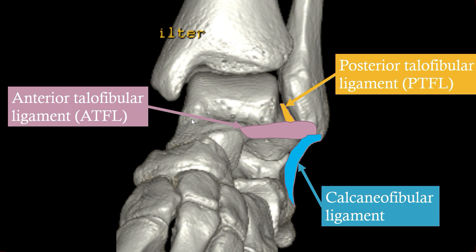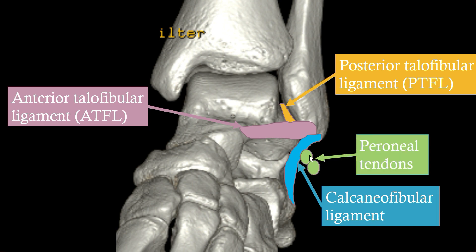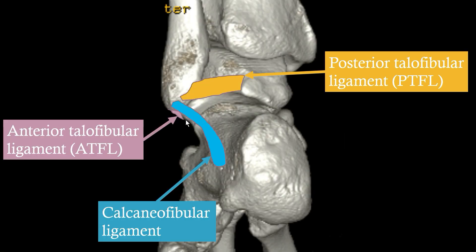From a coronal perspective, the anterior talofibular ligament has a more or less horizontal orientation, while the calcaneofibular ligament runs in a slightly banana shape. One reason for this is that the peroneal tendons run above the calcaneofibular ligament. So on coronal sequences, between the bone and the peroneal tendons, you will find the calcaneofibular ligament — that's an easy way to identify it. The PTFL is not clearly visible from this orientation.